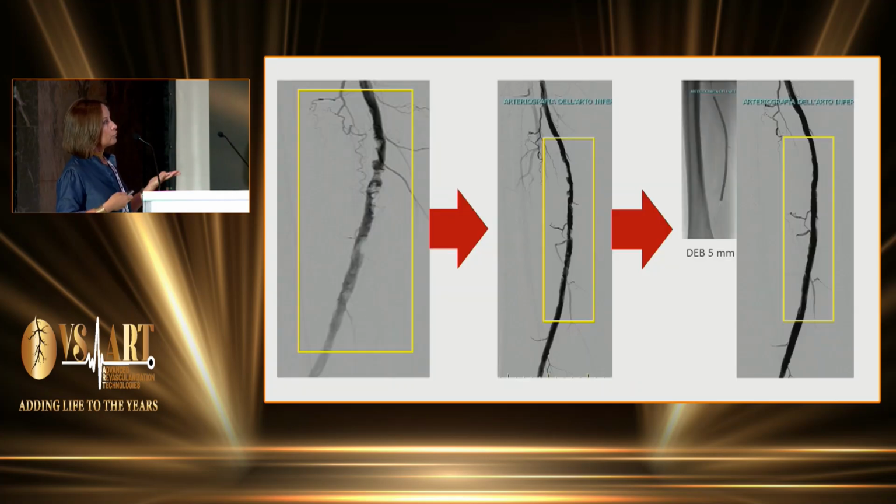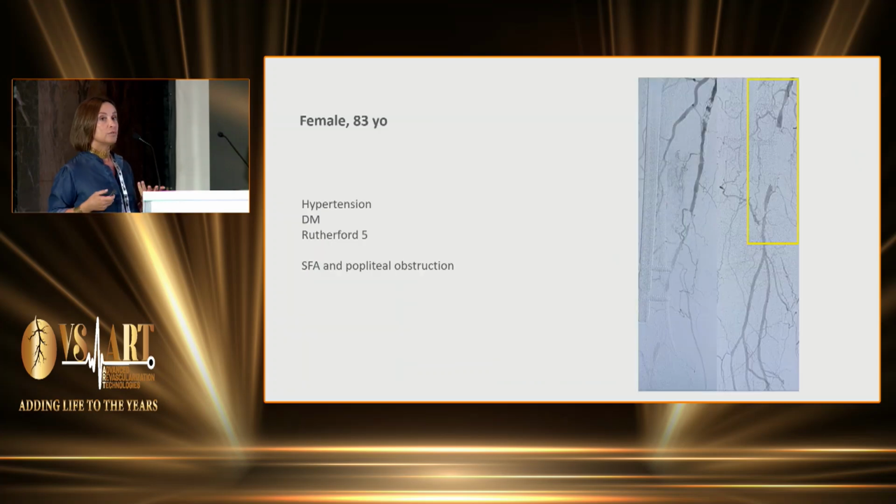We could, as you can see, partially remove the plaque. We performed PTA with a drug-eluting balloon, and that was the result. So without a stent, we could achieve really good work. But again, not every situation requires the same system.